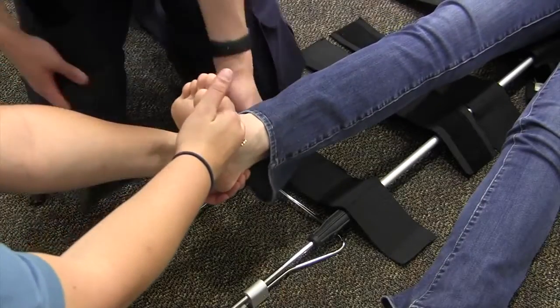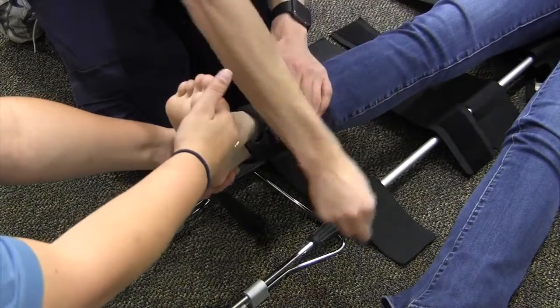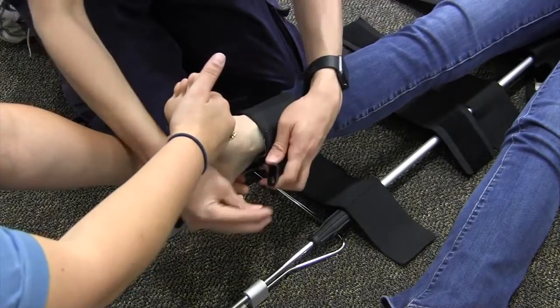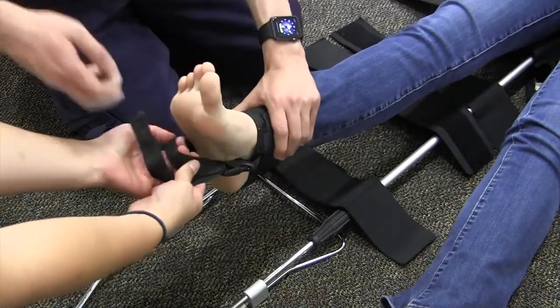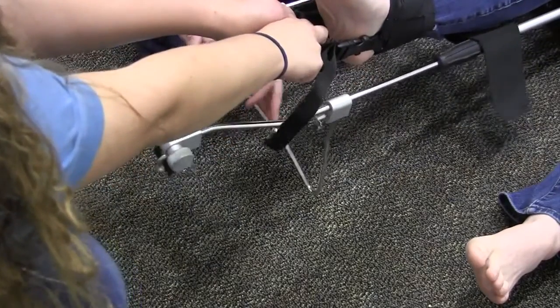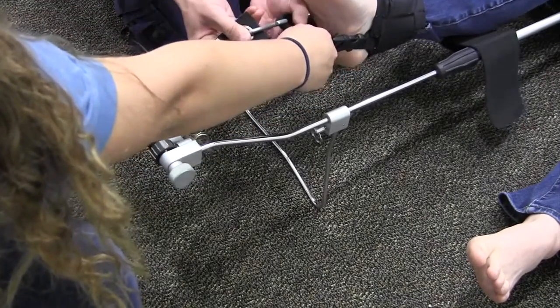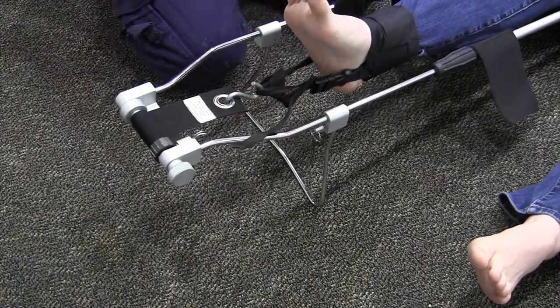With manual traction still being held, I'm going to take the ankle hitch and tie it around the patient's ankle. I'll take the clip part and clip it so that it is underneath the sole of the foot — now it can serve as the new grip for manual traction. I'm going to engage the kickstand, then take the apparatus hook and put it around the loop and pull for mechanical traction.